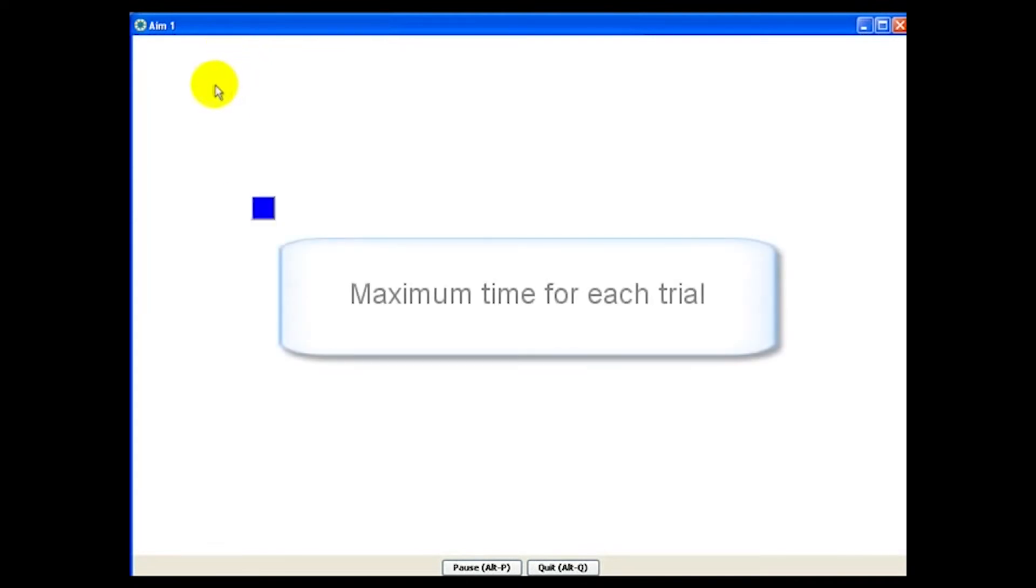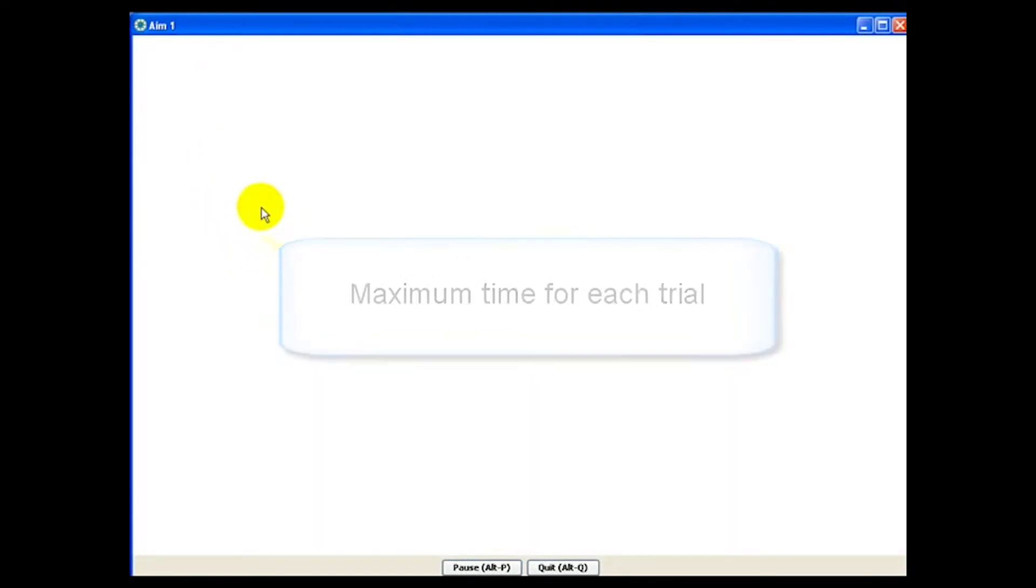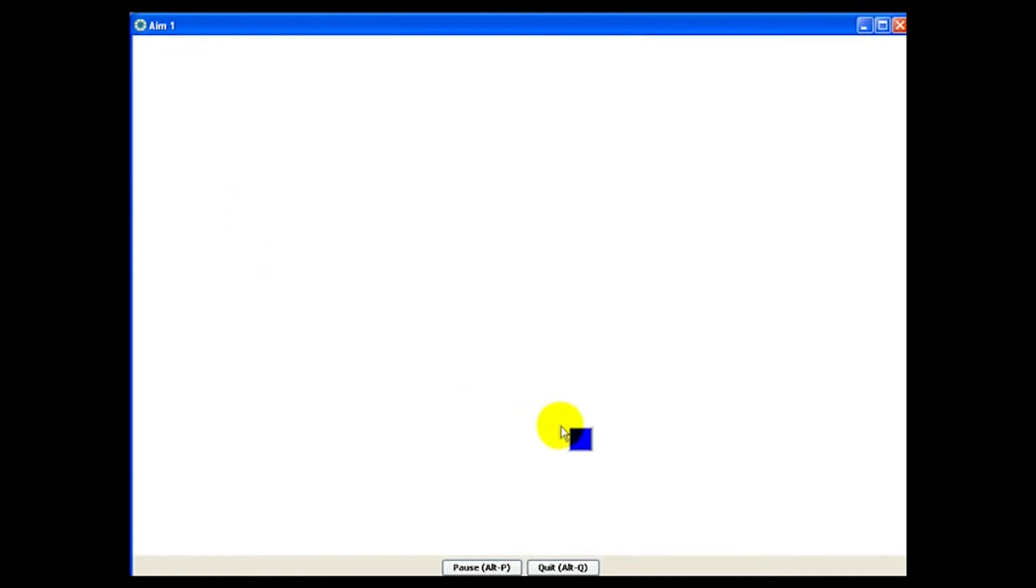Note that there's a maximum time for each trial. If a target is not selected by that time, Compass will automatically move on to the next target.